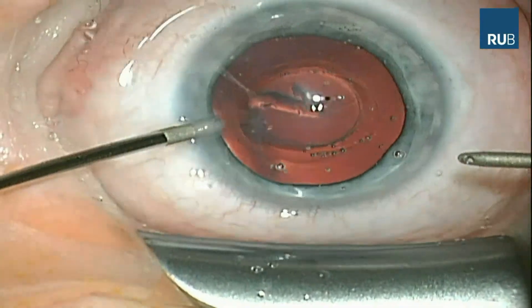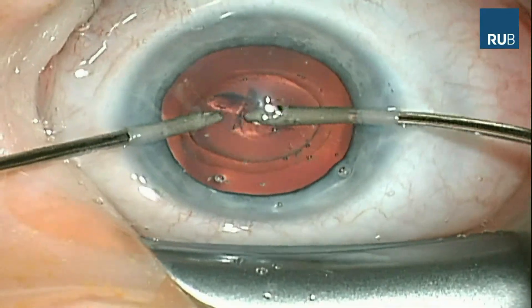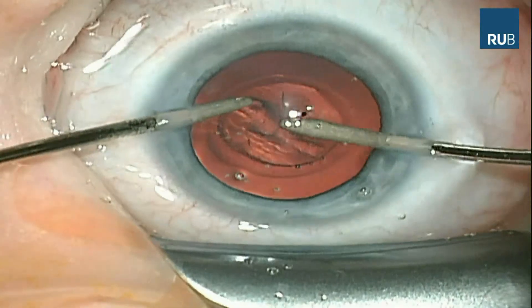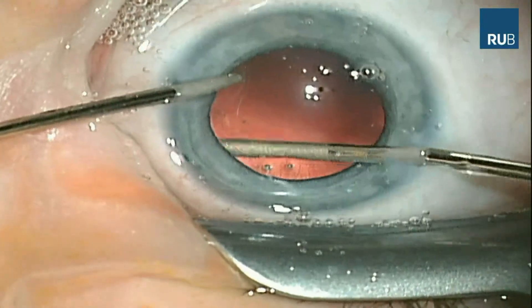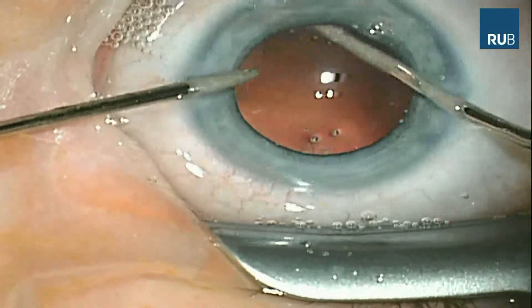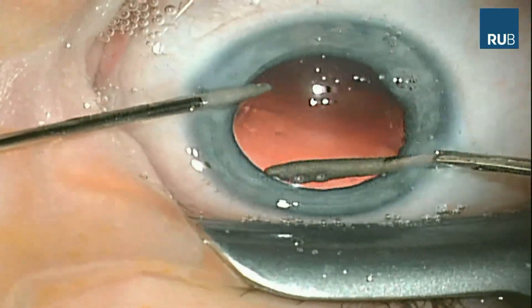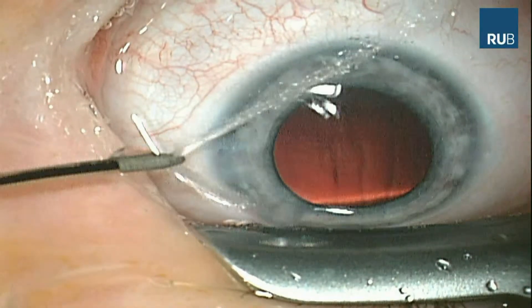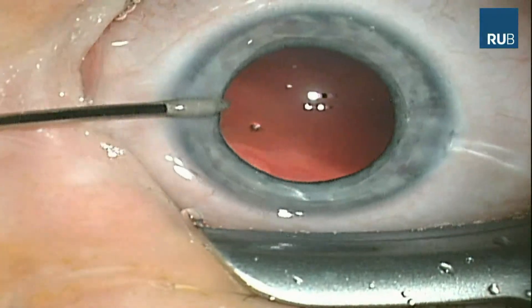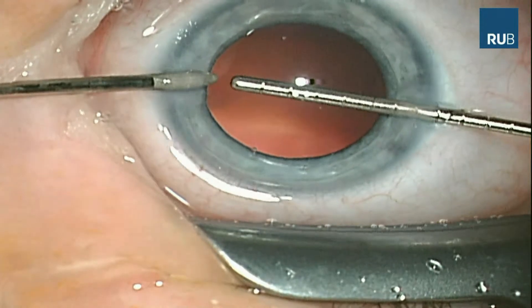The nucleus and the cortex are removed using bimanual irrigation aspiration handpieces, followed by polishing of the posterior capsule as well as the backside of the anterior capsule. After meticulous cleaning of all epithelial remnants, the capsulotomy diameter is measured horizontally using the Engel measurement device. The measured diameter is 4.6 millimetres, which is exactly what we aimed for.